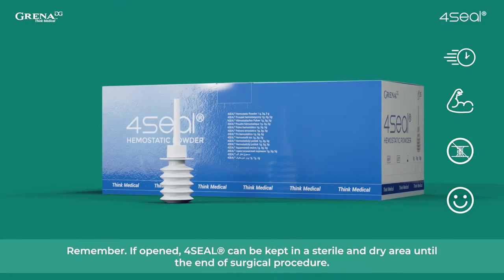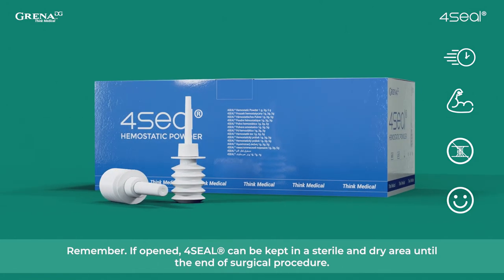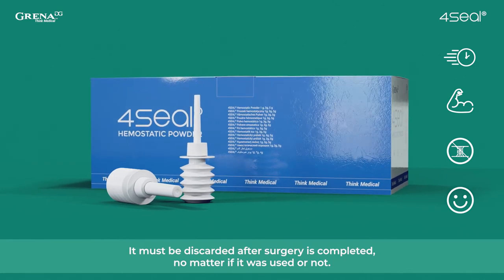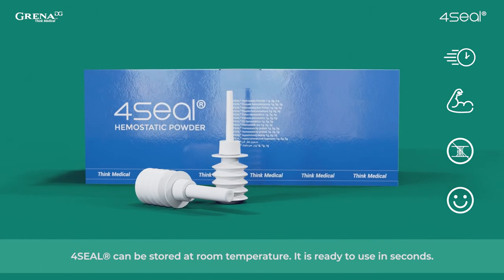Remember, if opened, 4Seal can be kept in a sterile and dry area until the end of the surgical procedure. It must be discarded after surgery is completed, no matter if it was used or not.